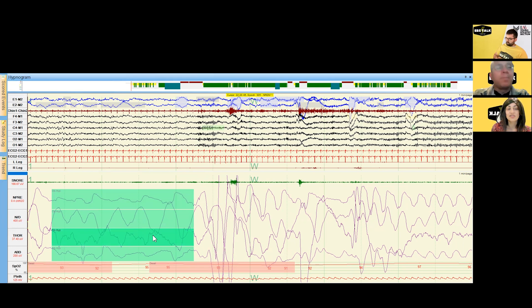We score this as an obstructive hypopnea because there is persistent respiratory effort in the thorax and abdomen while the nasal pressure signal is decreased. The arousal looks like the EEG speeds up. It's considered an arousal rather than an awakening because it's so transient — too short in duration. We call this a respiratory arousal because it's in close proximity to the respiratory event.